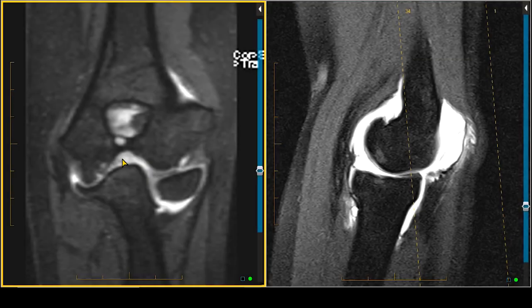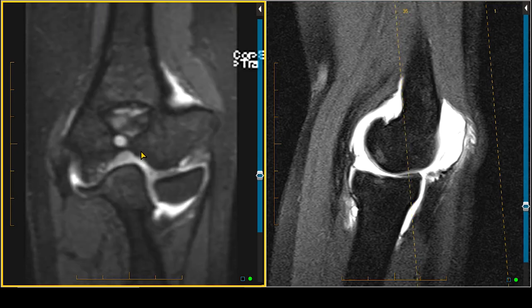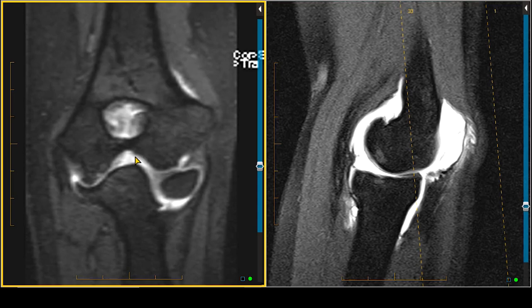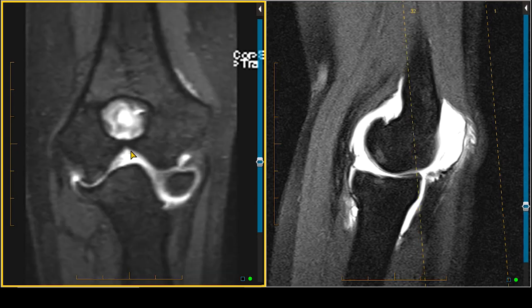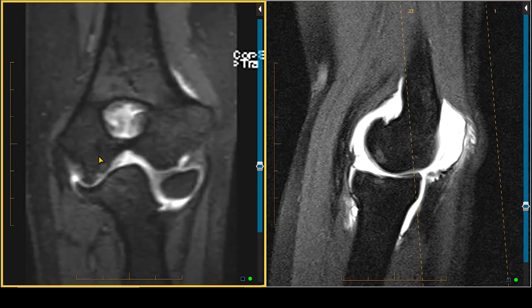In the last case we saw a little divot in the trochlea that was an osteochondral lesion. Here's another case of a little divot, but this is a much more serious condition. This is a result of avascular necrosis of the trochlea, which causes a fishtail deformity of the elbow. It's called a fishtail because both condyles come down like so, looking like the tail of a fish.